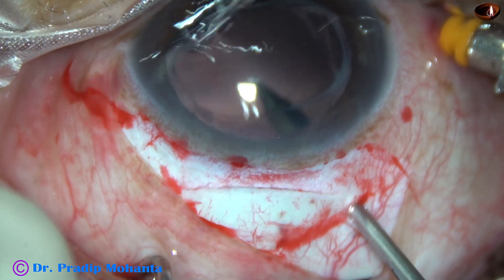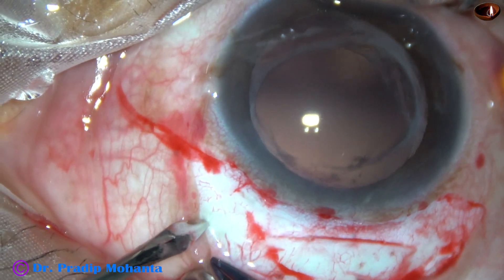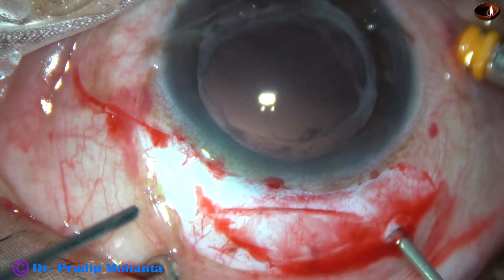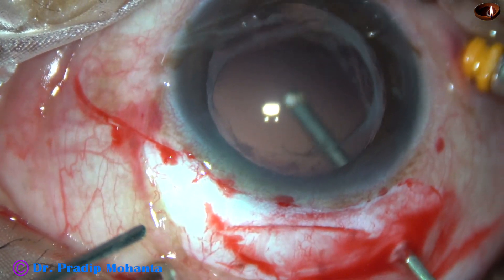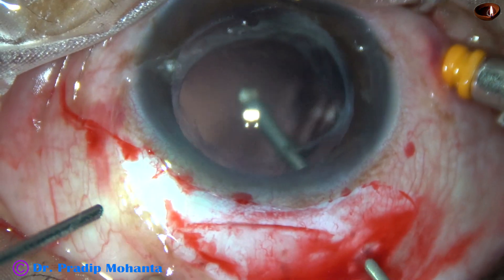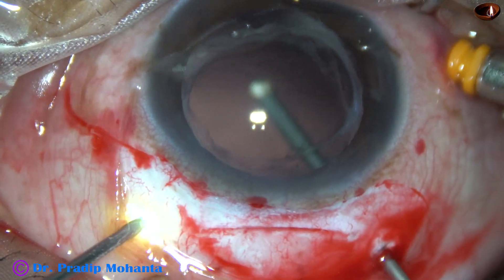One sclerotomy at 11 o'clock, the other at 1:30 o'clock. Now I start doing vitrectomy — anterior vitrectomy through the pars plana route. And we can see the intraocular lens dancing.